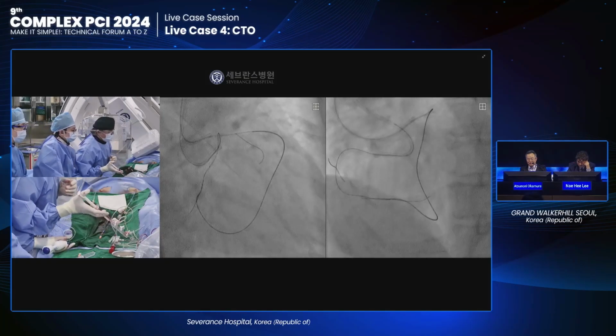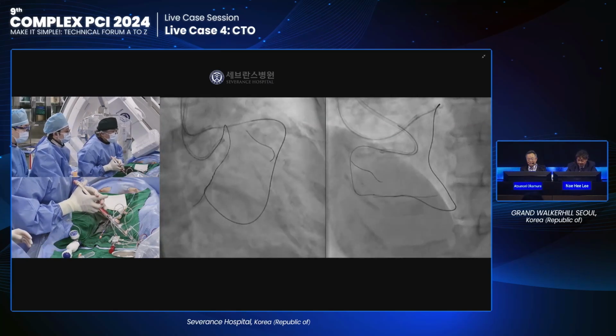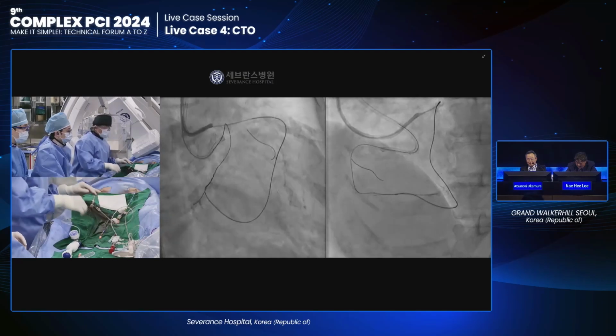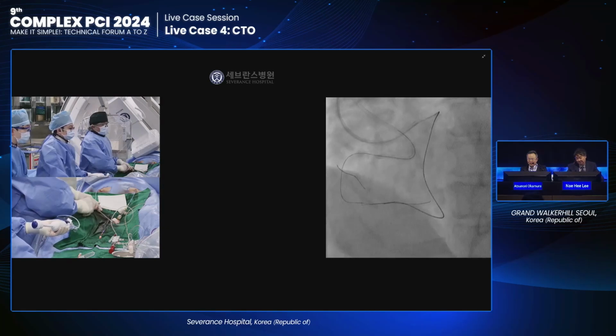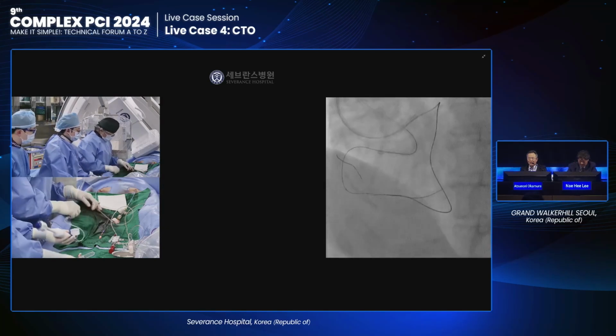Time saving. I just put some angiogram. Okay. Antegrade wire crossed. So you directed the proximal path. So maybe the guide wire course is changed after dilatation? Change it, right. You are right.